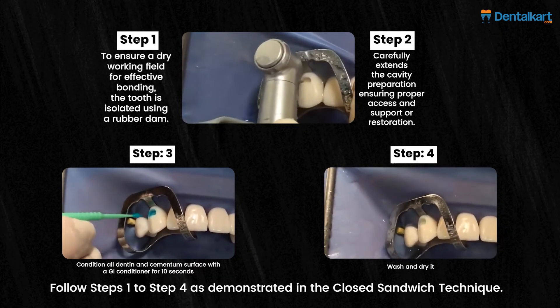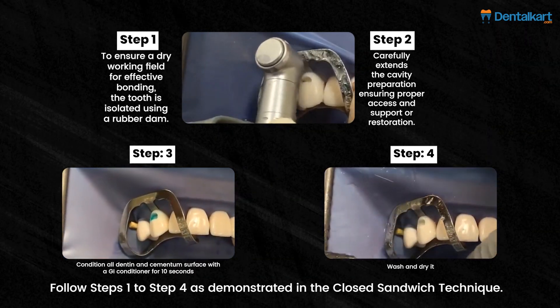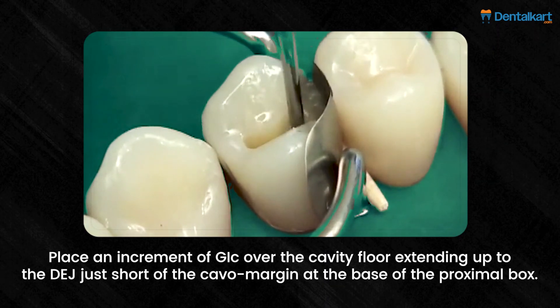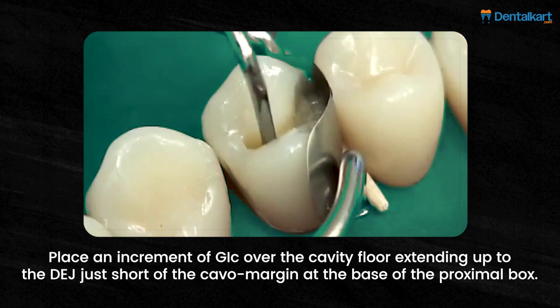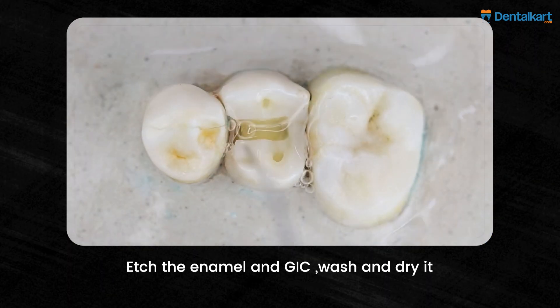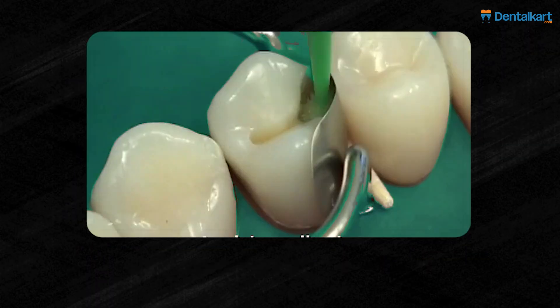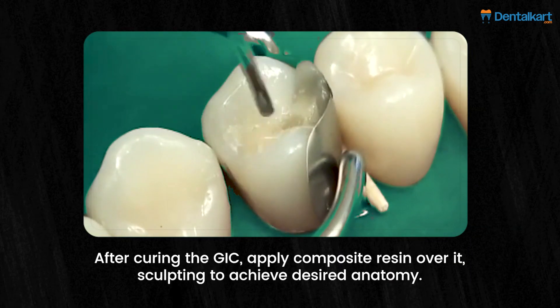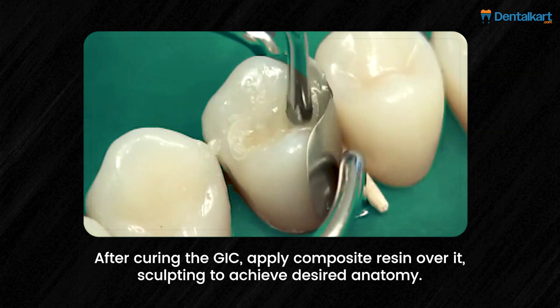Follow steps one through four as demonstrated in the closed sandwich technique. Then place an increment of GIC over the cavity floor, extending up to the DEJ, just short of the cavo-margin at the base of the proximal box. Etch the enamel and GIC, wash and dry, then apply bonding agent and cure.